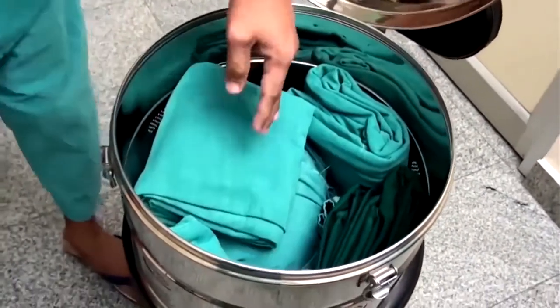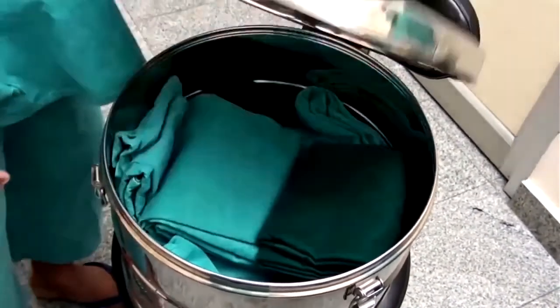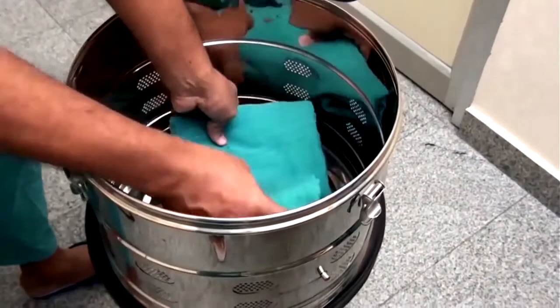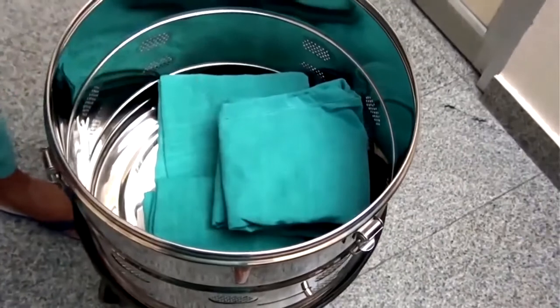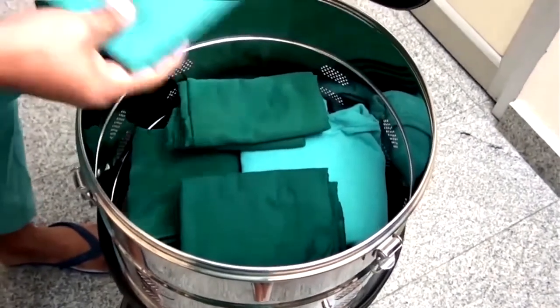Now bins are not being recommended for autoclave. If at all you are using, don't pack it like this, stuffed. Steam has to penetrate. So it's best that you pack it in a way that the steam penetrates adequately between the layers. So always have unidirectional, layer by layer, and don't pack it tight.